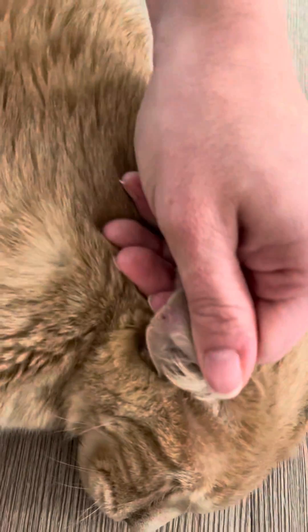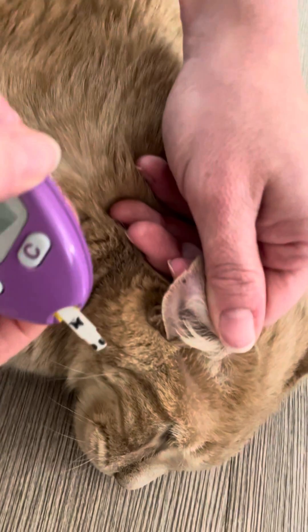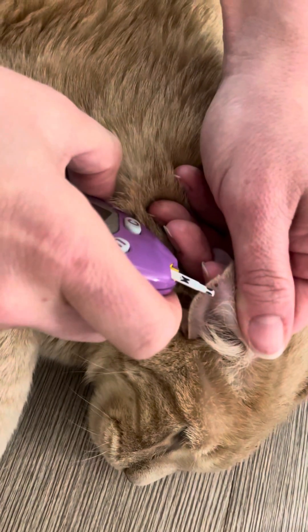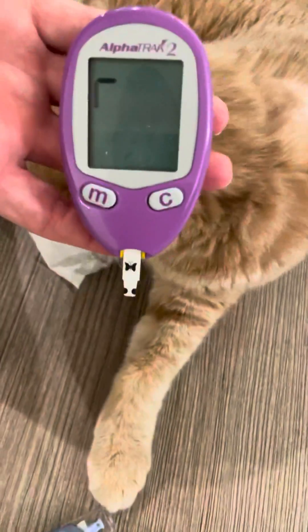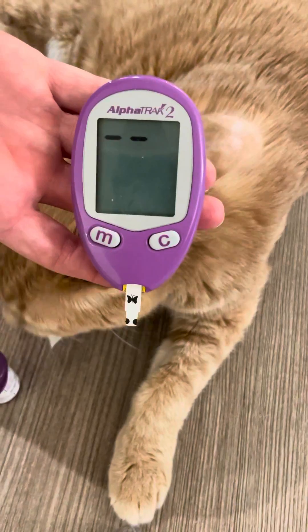You see a drop of blood and then you take that on the end where the black is, and do it only on one side. You'll get a beep and his result.